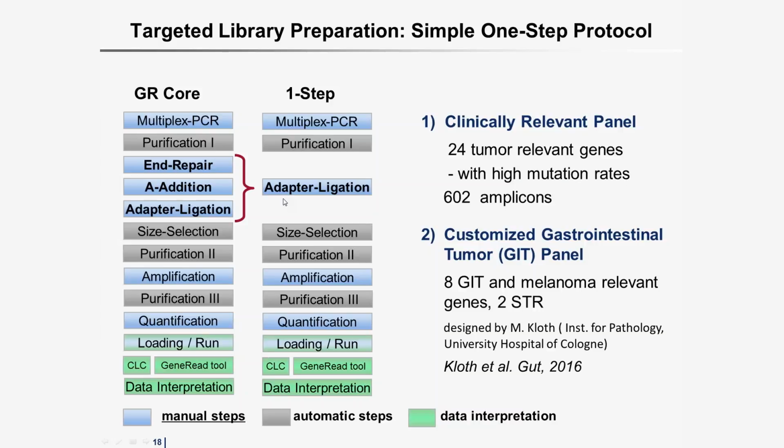And we always try to avoid multiplex amplicon handling because we have a very high throughput in our labs, and therefore we are always afraid of getting putative contamination by the amplicons. And so we think that saving handling of amplicons is a really attractive step.